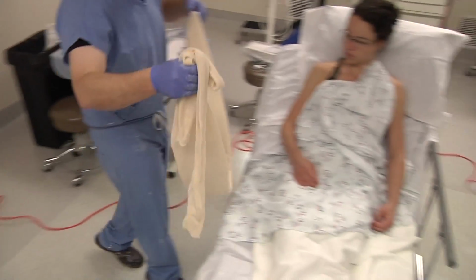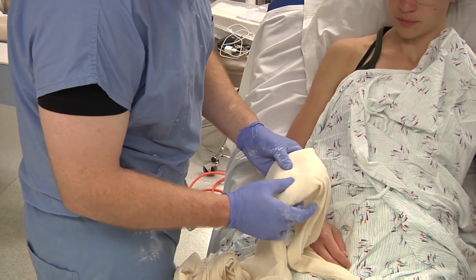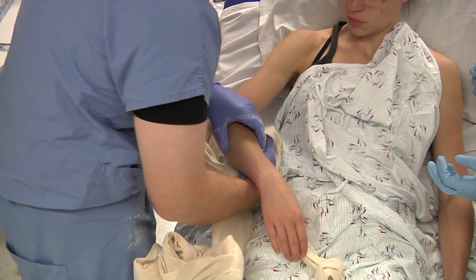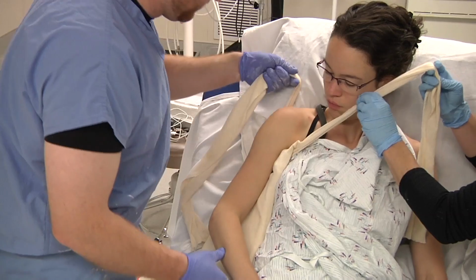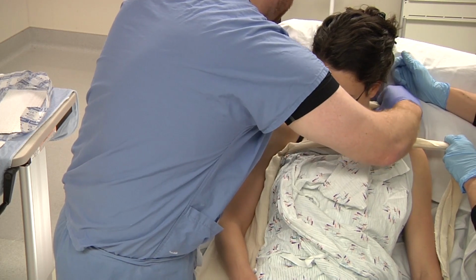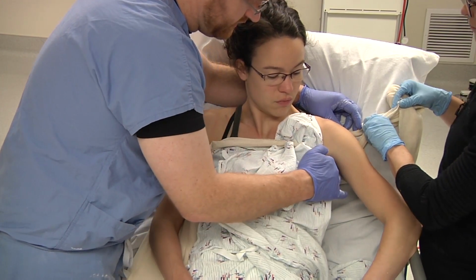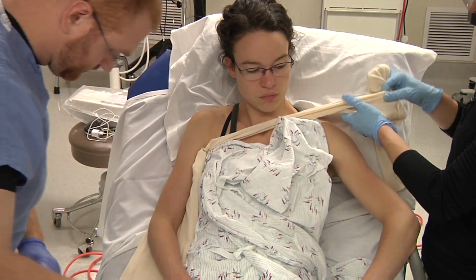Next, Dr. Thayer will help me. You'll know where the end of your padding is. You should still have ample padding at the end. So this is where it's a little more invasive than some of the other splinting techniques. You do need to lift the patient's arm, get the padded portion into the axilla. And then from there, there's varying techniques for how to tie this off. You can come around the patient, either strap it underneath the other arm, which can cause some irritation in the contralateral axilla, or you can simply go around up high.